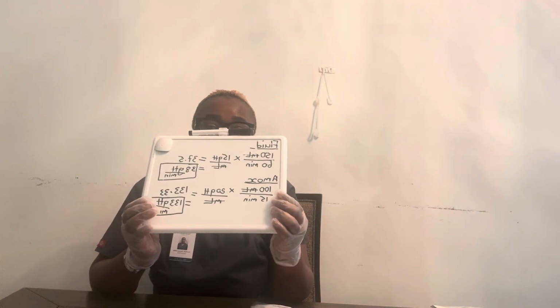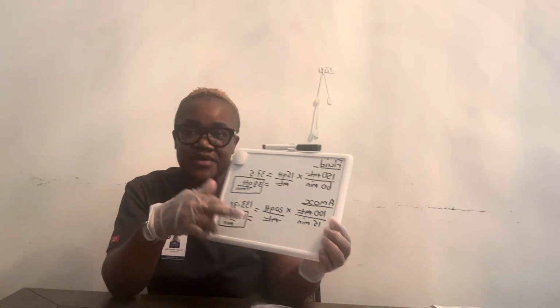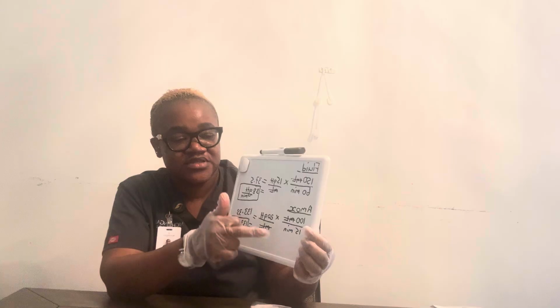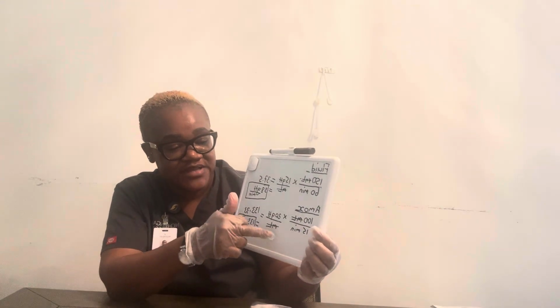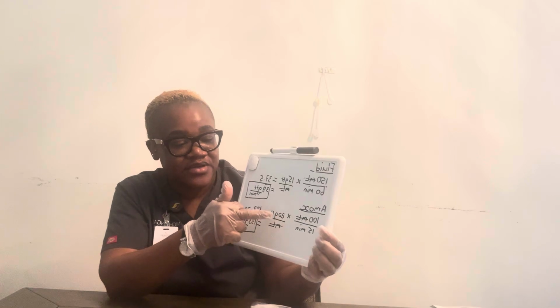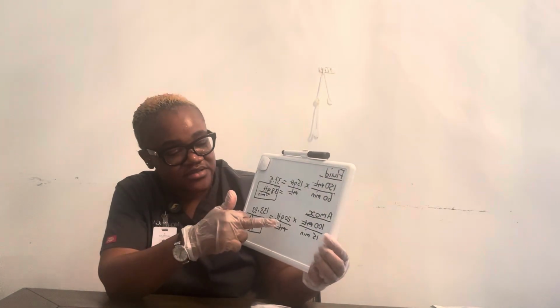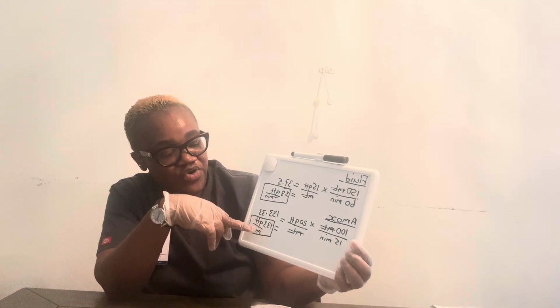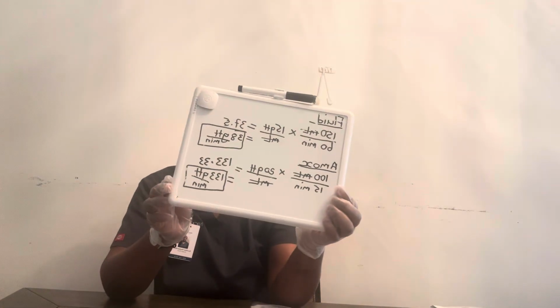And for the amoxicillin, this was ordered at 250 milligrams, which is supplied in 100 milliliters over 15 minutes. Our macrodrip rate is at 20 drops per ml. So with that calculation, we're going to have 133 drops per minute.